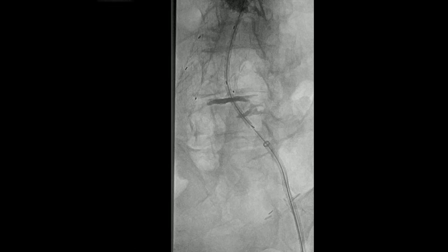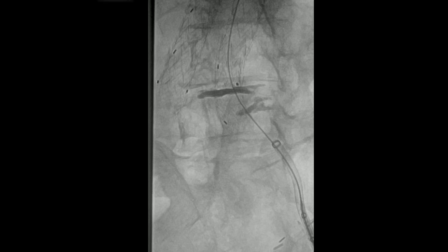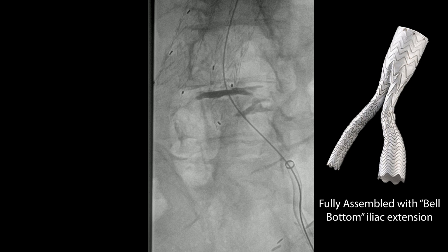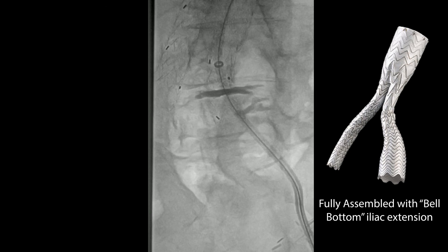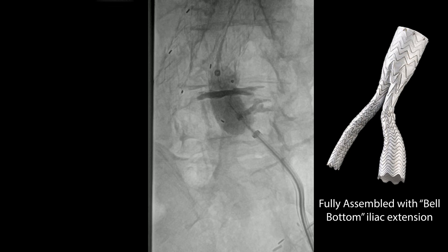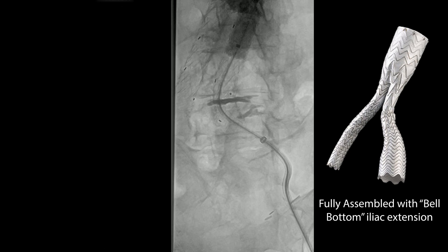We're going to position the device. Of course, we're working off two screens, so we know where the hypogastric is. The device has been deployed. Once again, we're going to balloon this. Here you can see even the balloon is catching, so once again you go through the same rigmarole: bring the balloon out, put the dilator inside the sheath, readvance the sheath inside the limb, and then you can bring up the balloon inside the sheath where it's protected. Once the balloon's brought up, you're going to do the overlap zones and the seal zone distally. You can also see where it expands up beyond the iliac limb into the more aneurysmal portion of the iliac artery.